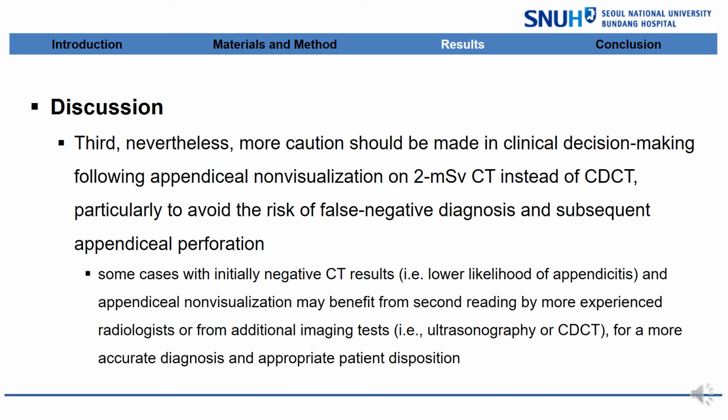Third, nevertheless, more caution should be taken in clinical decision-making following appendiceal non-visualization on 2 millisievert CT, particularly to avoid the risk of false negative diagnosis and subsequent appendiceal perforation. Some cases in our study with initially negative CT results and appendiceal non-visualization may benefit from second reading by more experienced radiologists or from additional imaging tests for more accurate diagnosis and appropriate patient disposition.